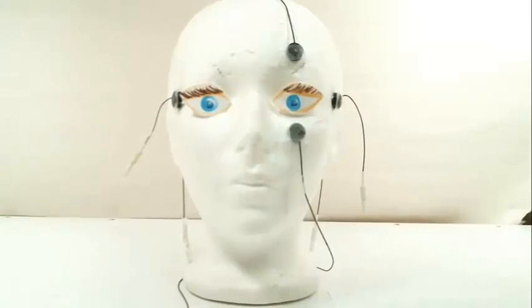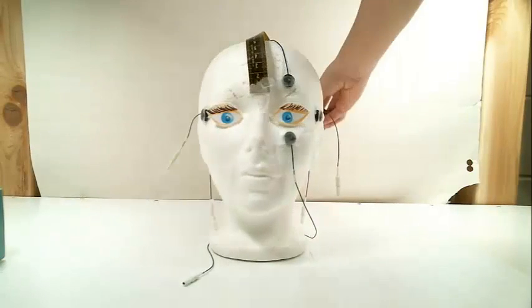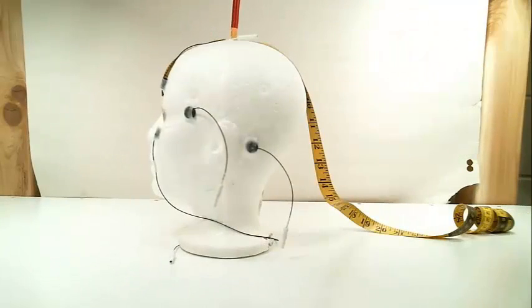Now we need to measure the head to fit the cap. The caps are sized to the head based on the measurement from the nasion, which is right between the eyes, to the inion, the notch at the back of the head. After finding the middle of the head, we mark it with a red pencil on the scalp.